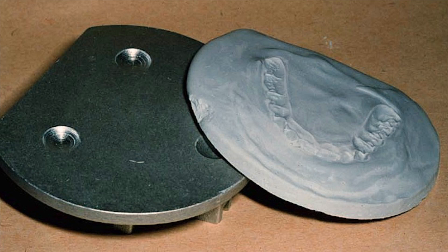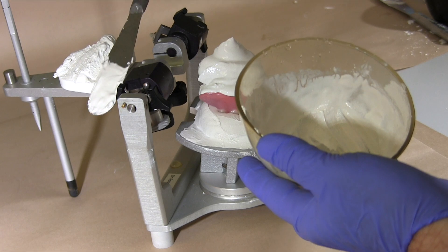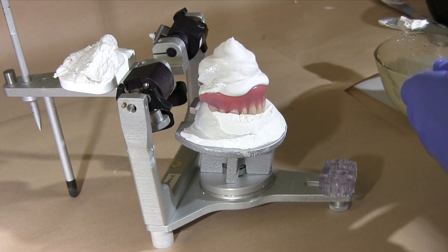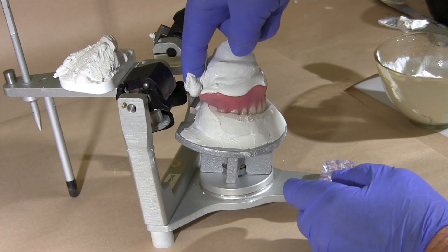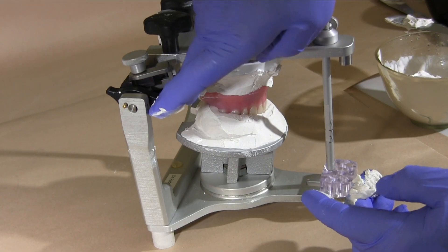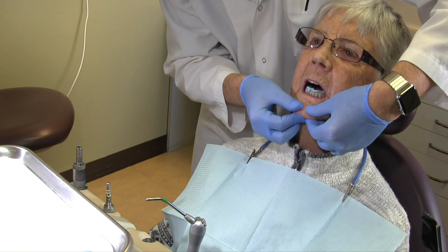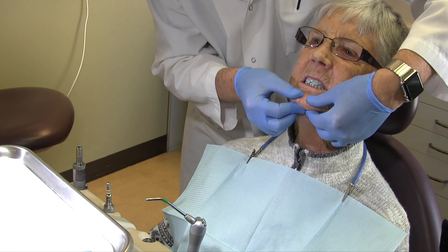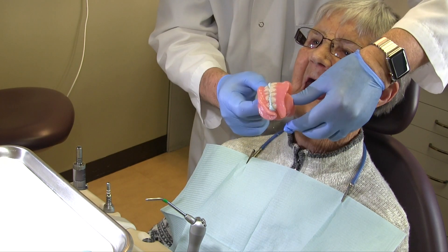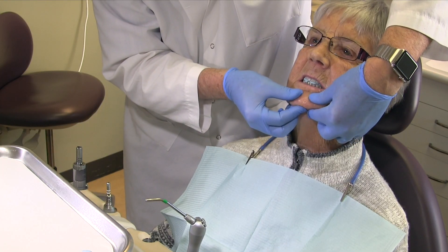Request fabrication of a remount index and maxillary and mandibular remount casts when you send your prescription in for processing of dentures to your laboratory. Also request that the maxillary cast and denture be remounted using the index prior to return. If your laboratory follows these steps, you will only need to make a centric record to remount the mandibular denture. Make a centric record using elastomeric bite registration material, guiding the patient into centric relation position. Then take a second record to be used as a check later.